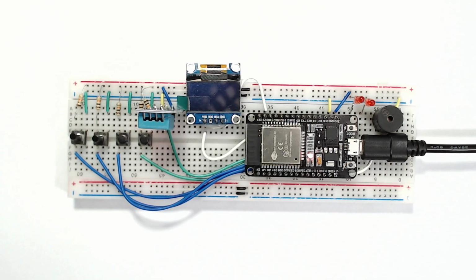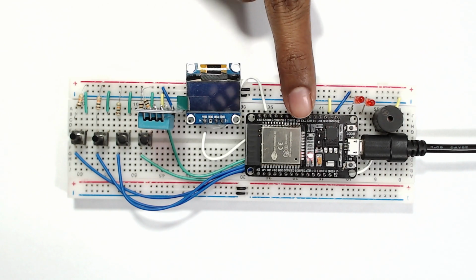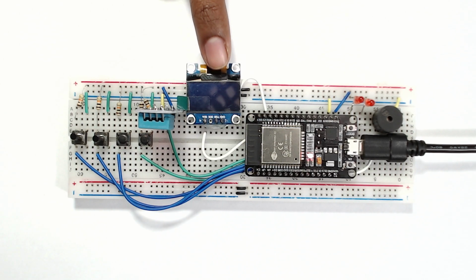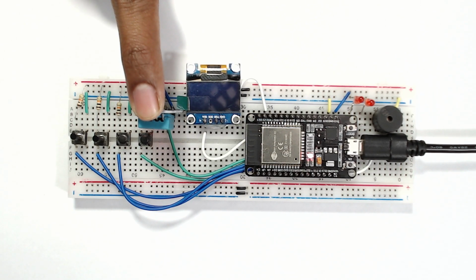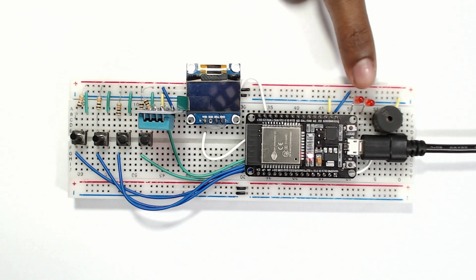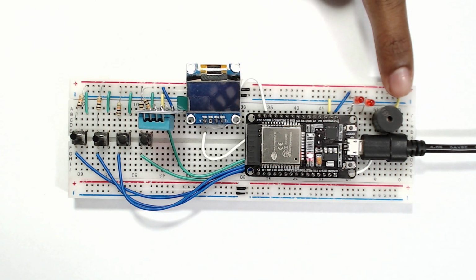This is the breadboard circuit we have made for the MediBox. Here you can see the ESP32 board, the OLED display, the DHT11 temperature and humidity sensor, 4 push buttons, 2 LEDs, and 1 buzzer.